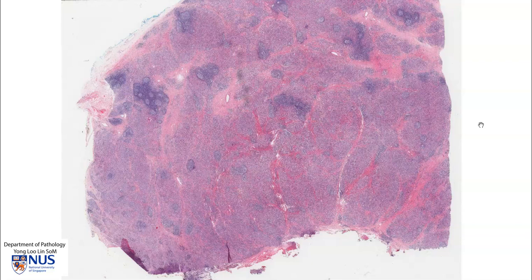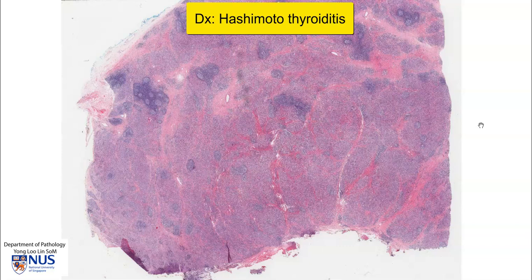Hello, this is a virtual microscopy slide of a case of Hashimoto thyroiditis. Hashimoto thyroiditis is an autoimmune condition where there is a breakdown of self-tolerance, and so there is immune-mediated destruction of the thyroid parenchyma. This can eventually lead to hypothyroidism.